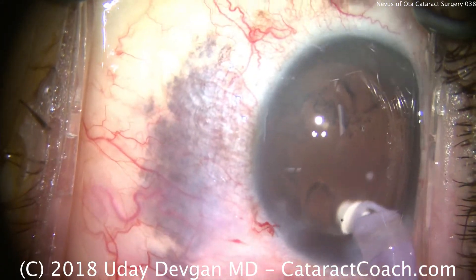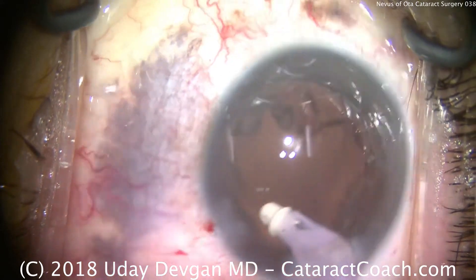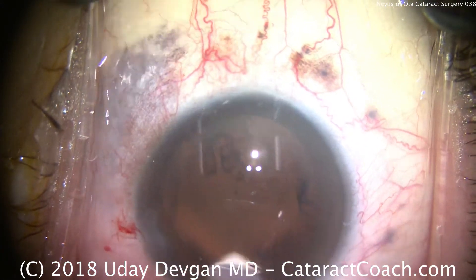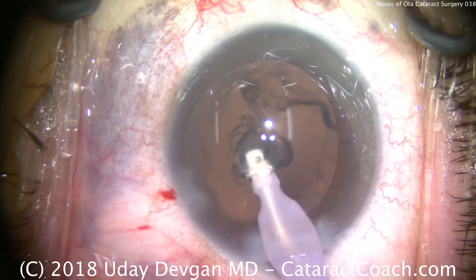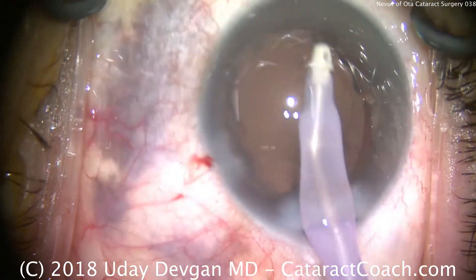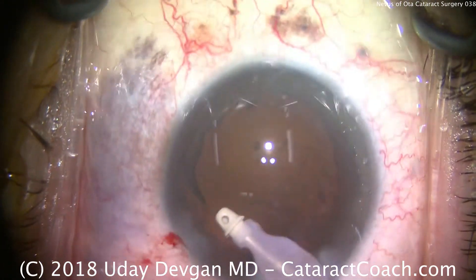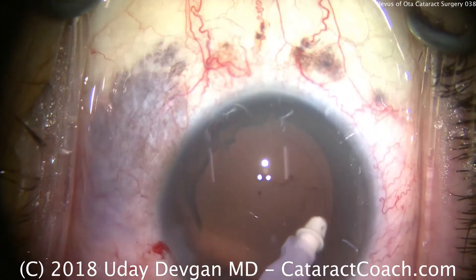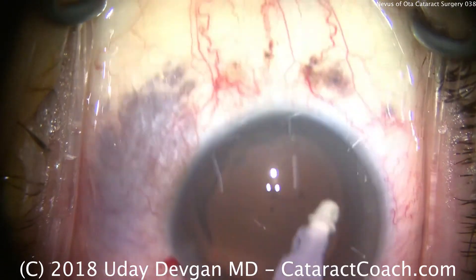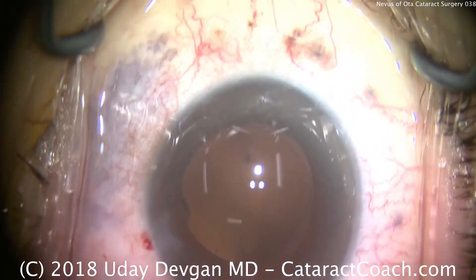We'll be careful in removing the cortex. In this case, we're going to put in a monofocal aspheric lens — a single-piece acrylic. Clean up the remainder of the cortex. The capsular bag looks good, and all tissues have held up nicely. Perhaps I'm being a little overly cautious, but I'd certainly rather err on the side of being too cautious.